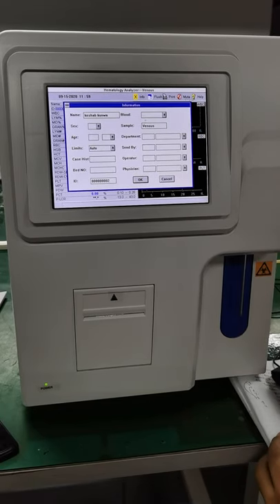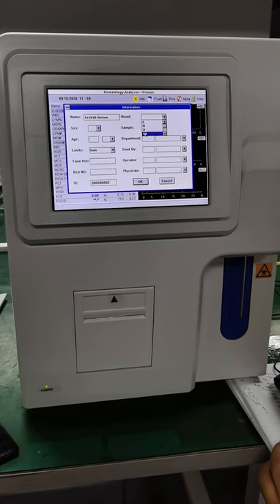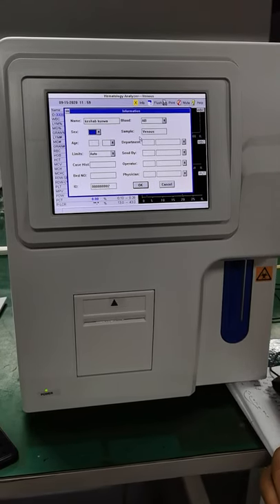And blood group may be AB, okay, the sex is male, venous blood, and Keshav is 30 years old. And department, he is from pediatrics. Sorry, not pediatrics, 30 years old cannot be pediatrics, right?